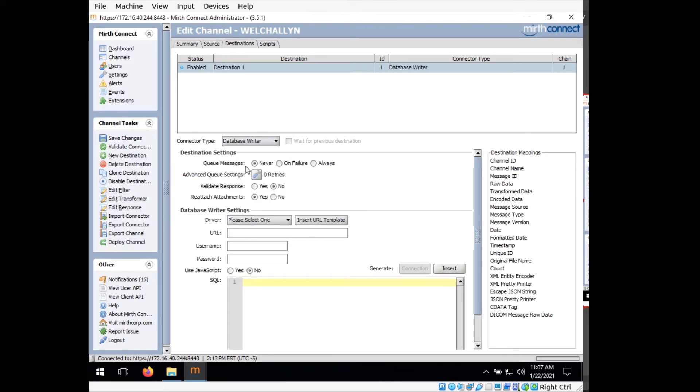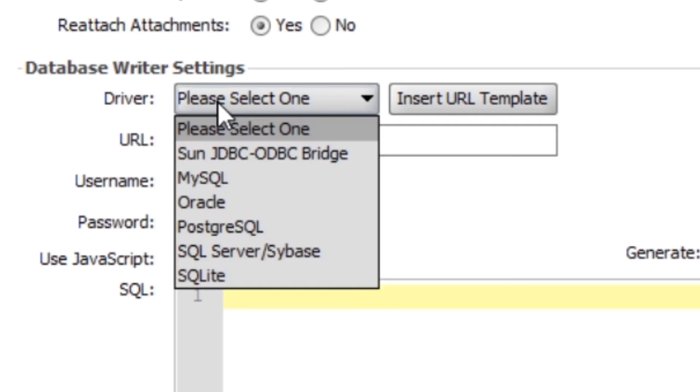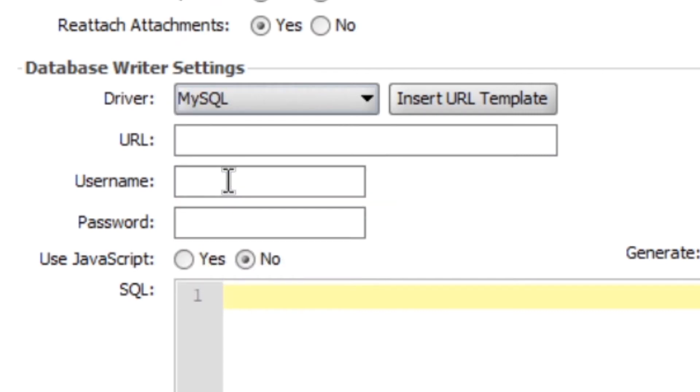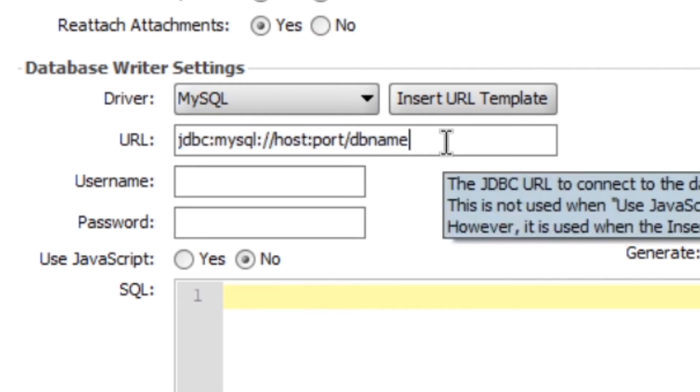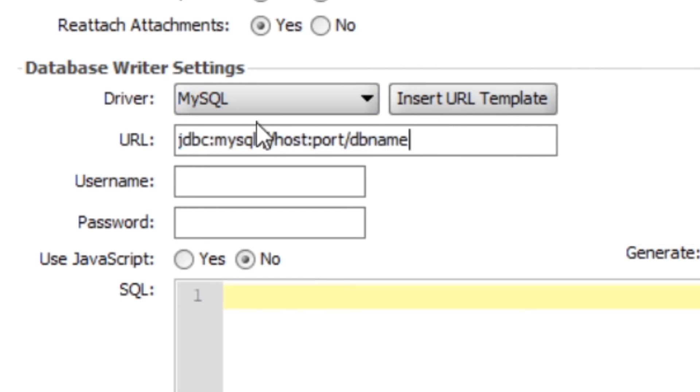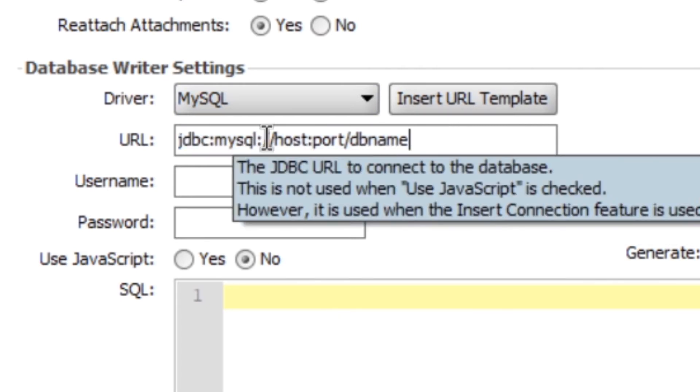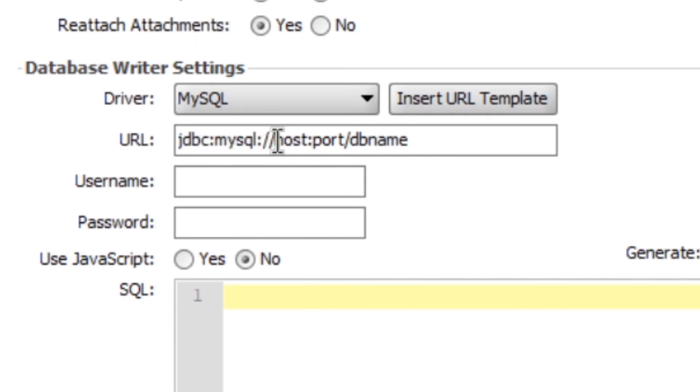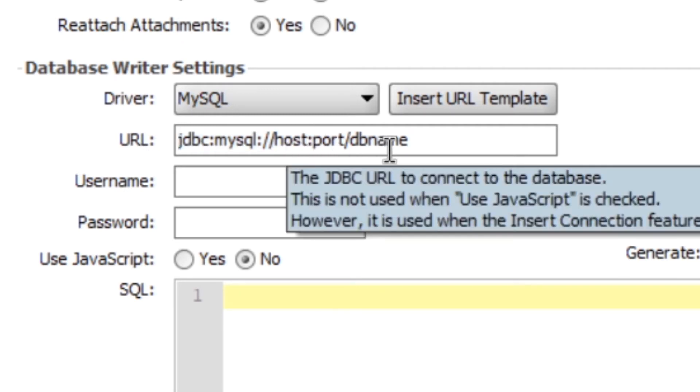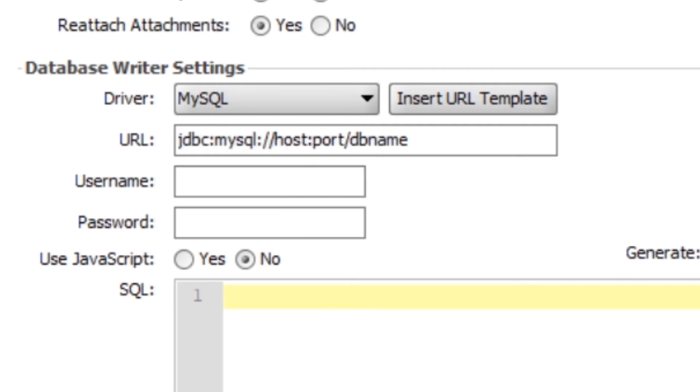Now down here, under driver, we want to select MySQL. What we can do is we can click insert URL template and it will give us an idea of what our string here should look like. So under URL, we want to keep everything that comes before these two forward slashes. But we need to change host, port, and db name to match our database.